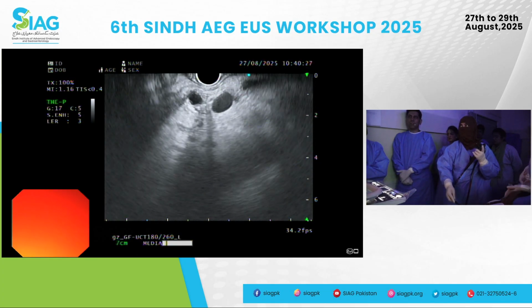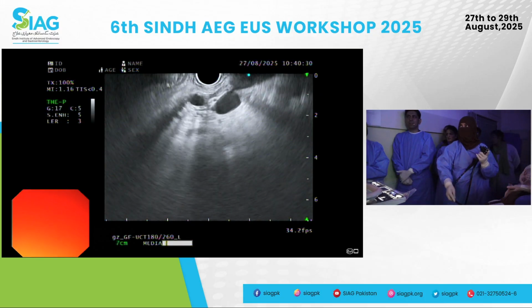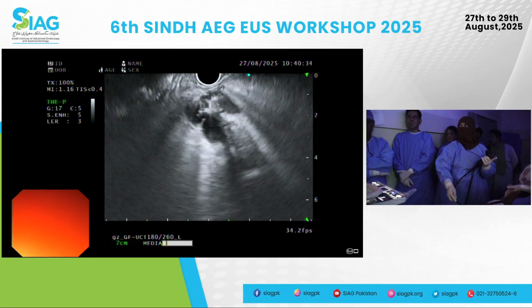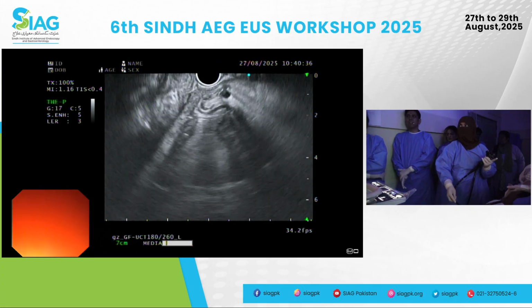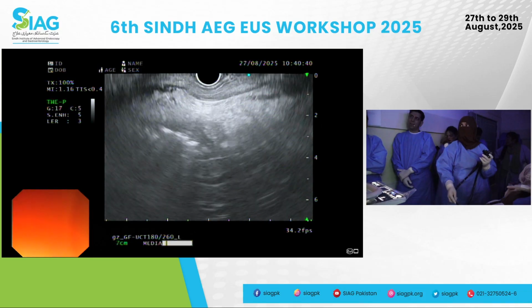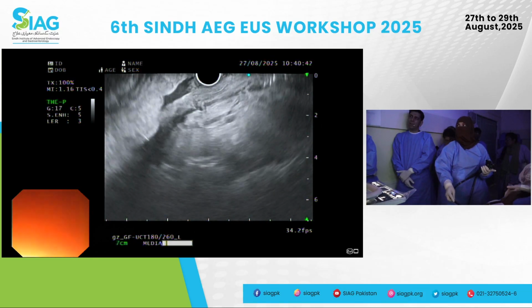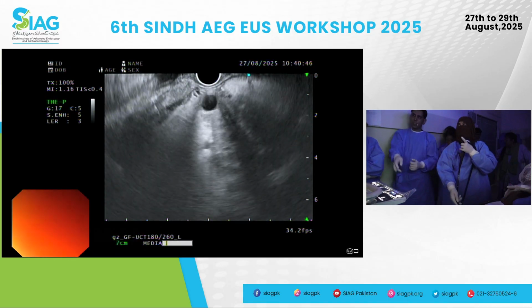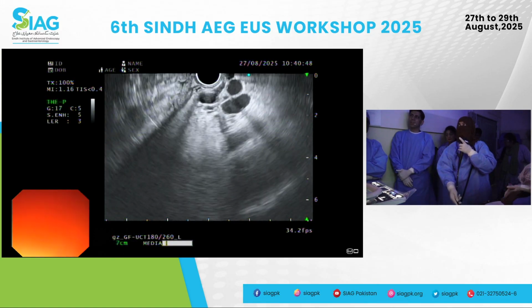Very nice. That's good. So keep scanning in the same plane. So again, undo it. Go back. I think you just briefly saw the kidney there.